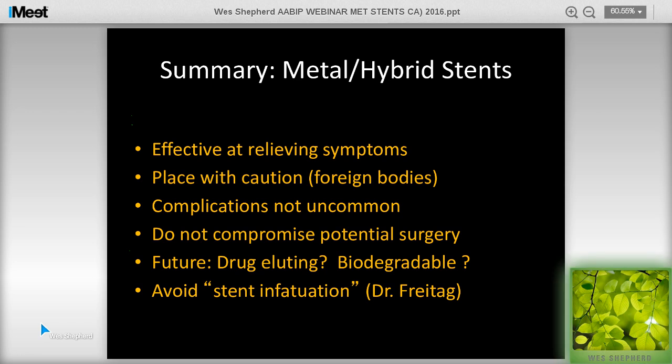Yeah, another great question, sort of a stent maintenance question. So for really all of our stent patients, whether it's metallic stents in malignancy, silicone stents in benign disease, Y stents, we pretty much put all of our patients on some type of nebulized therapy, and that may be, if they're already on bronchodilators, an albuterol nebulizer twice a day. If they're not requiring any bronchodilators, we'll do nebulized saline, and we usually ask them to do it at a minimum twice a day. And that's pretty standard for all of our stent patients, and we don't really alter that a whole lot between benign disease and malignant disease.